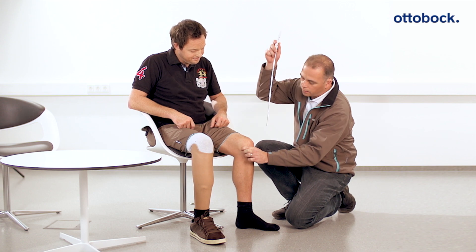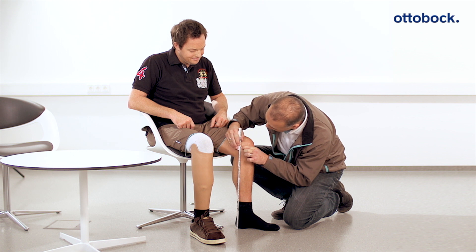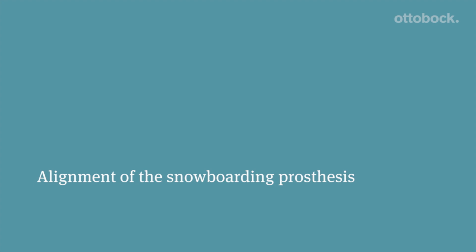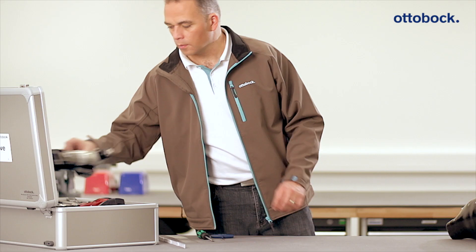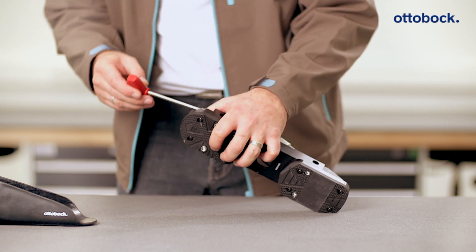The correct medial tibial plateau to floor measurement for the patient should be determined on the intact side. It is determined while the patient is sitting. After you have determined these measures for the user, the bench alignment of the prosthesis begins.